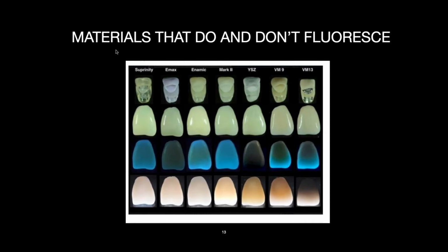You just have to know what they look like. And one of the big problems we have in the lab industry is that nobody really knows what a material is supposed to look like. So let's say you're buying a puck of some zirconia, 8.2 or whatever. Well, at what thickness is it an 8.2? I mean, you can't make everything the same thickness, and it's really difficult to try to figure this out unless the lab does the homework.